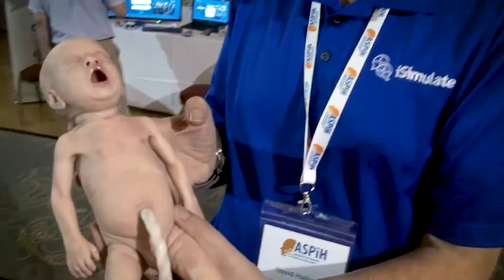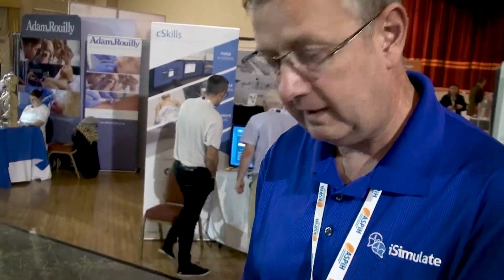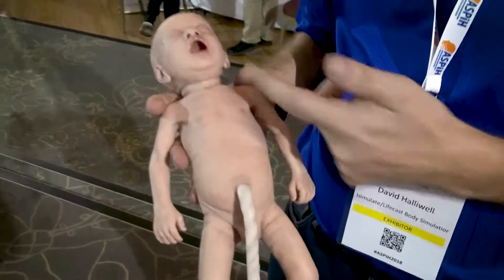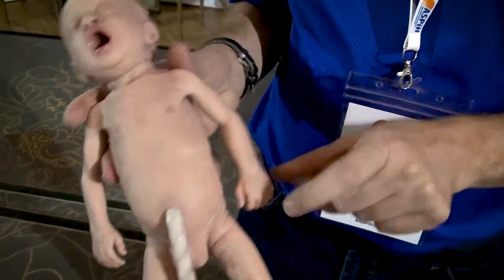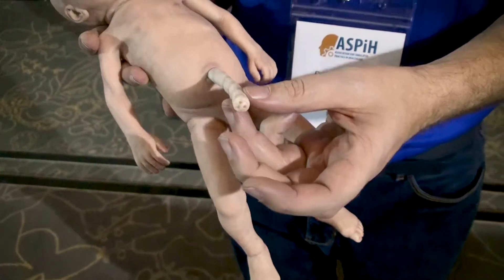This is a 29-week-old infant, and what you can see in front of you is a full ALS mannequin. This little chap takes a nasogastric tube, he's already intubatable, he's ventilatable, he's IV cannulatable, he's scalp cannulatable, and we've got cord access through here.